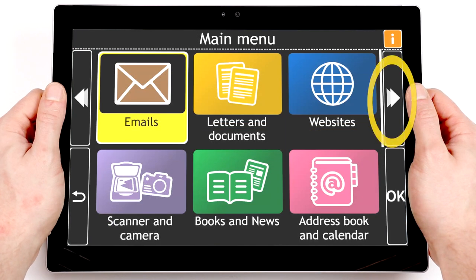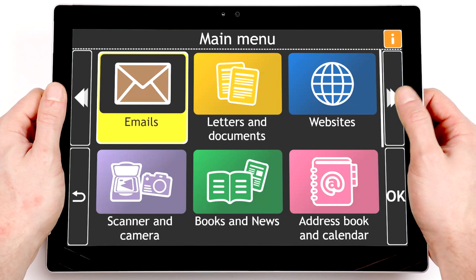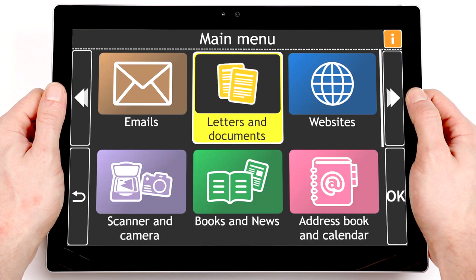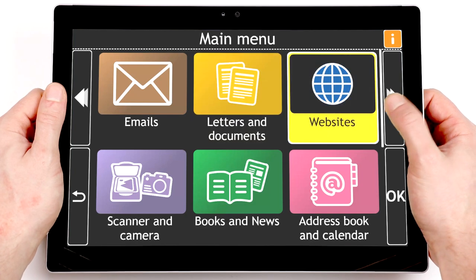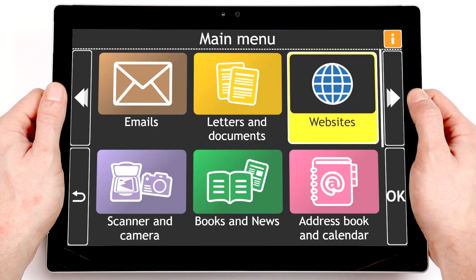The Next button on the right edge moves you to the next item on the screen. Letters and Documents, 2 of 10. To write a new letter or document, select this option. Websites, 3 of 10. To visit websites, select this option.